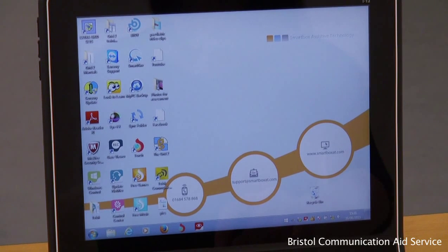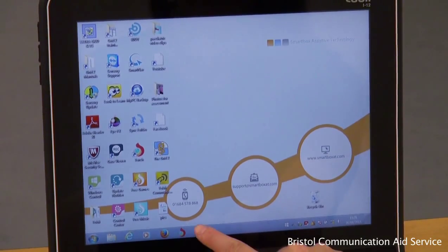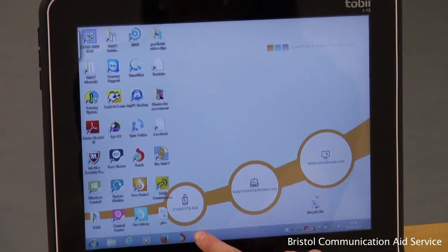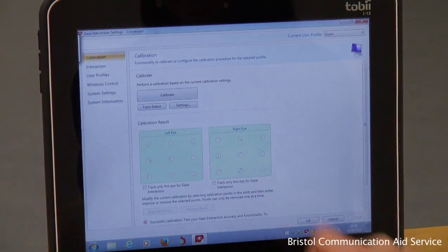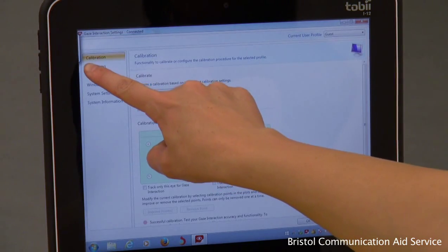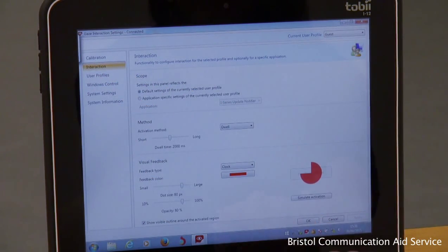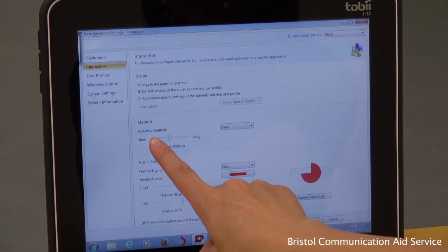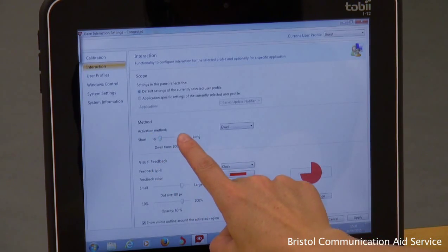To speed up or slow down the dwell selection timing, select the eye gaze icon to open the calibration screen. From the toolbar on the left, select Interaction. Here you can alter the speed accordingly under activation method. Short will speed it up and long will slow it down.